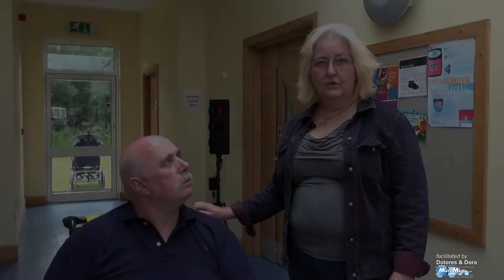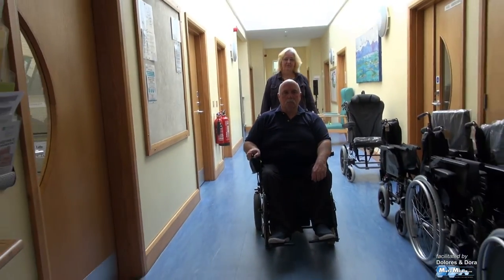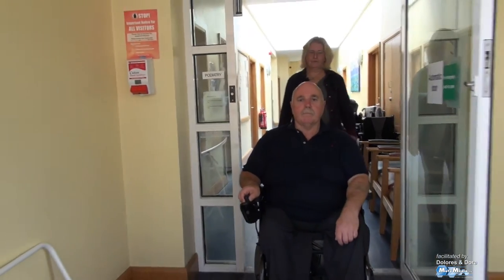In order to be safe inside buildings, it's necessary to take a centre line in the corridor in a powered wheelchair, so that people exiting doors or coming around corners and people pushing trolleys do not collide with you. So we're going to proceed down the middle of the corridor now. Okay, stop there.